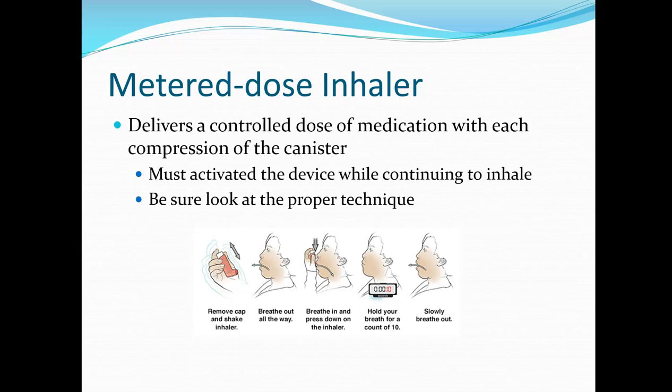Okay, we also want to know how to use metered dose inhalers. Some of our patients will have these, and we'll need to make sure that they're doing it correctly. So what it does is it delivers a controlled dose of medication with each compression of the canister. You must activate the device while continuing to inhale, and be sure to look at the proper technique.